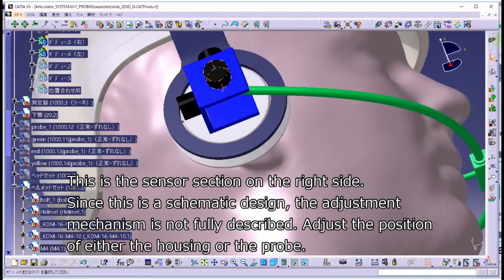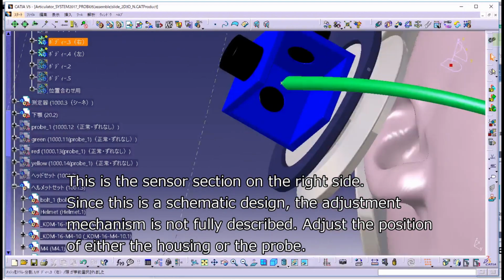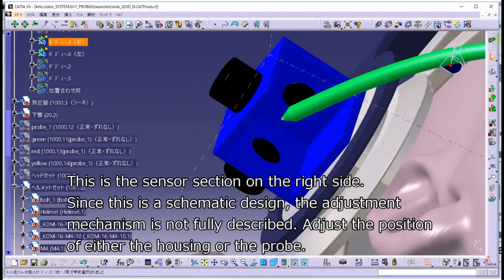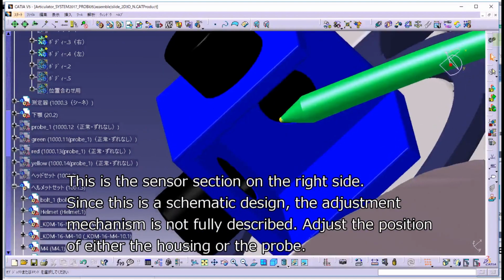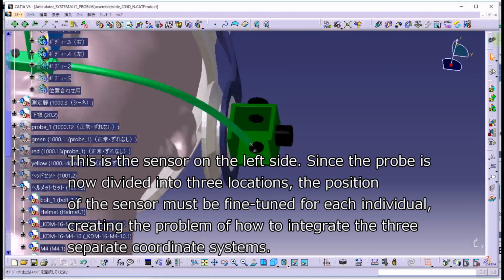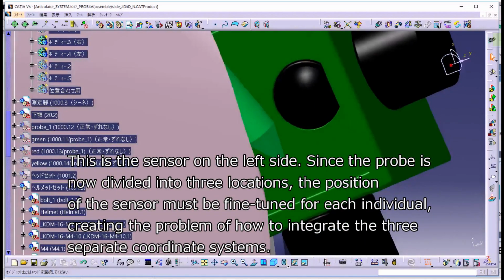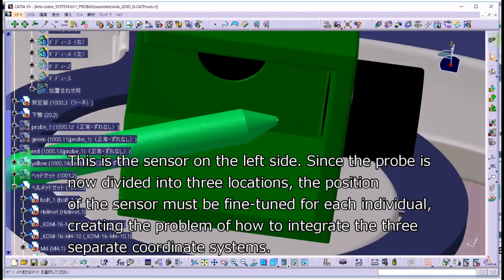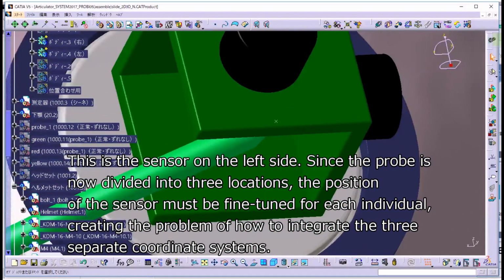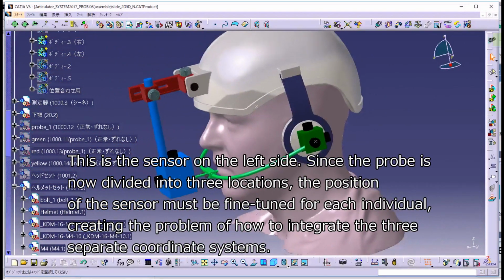This is the sensor section on the right side. Since this is a schematic design, the adjustment mechanism is not fully described. Adjust the position of either the housing or the probe. This is the sensor on the left side. Since the probe is now divided into 3 locations, the position of the sensor must be fine-tuned for each individual, creating the problem of how to integrate the 3 separate coordinate systems.